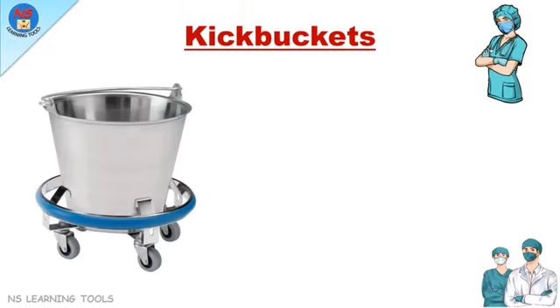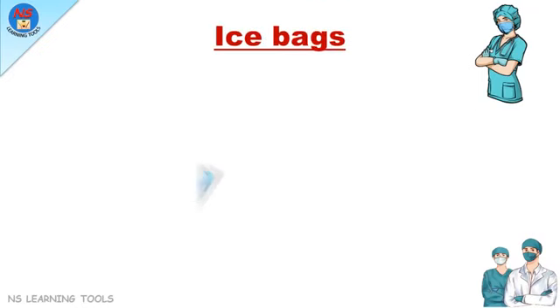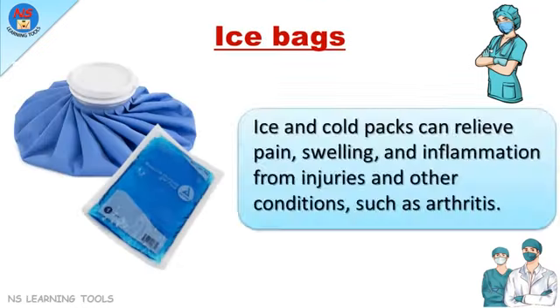Kick buckets. The kick bucket is used during a surgical procedure for the disposal of number of pliable and disposable articles. Ice bags. Ice and cold packs can relieve pain, swelling, and inflammation from injuries and other conditions, such as arthritis.